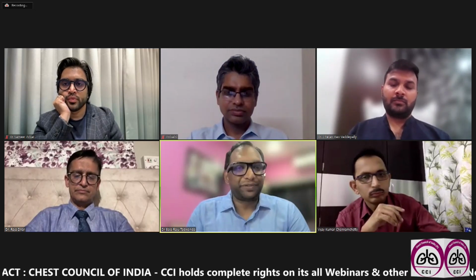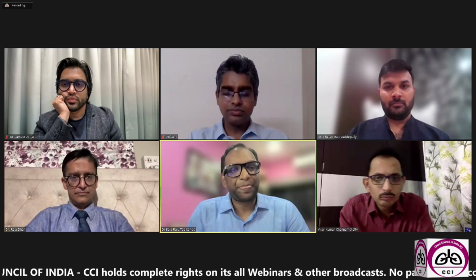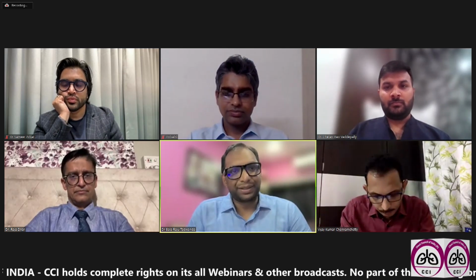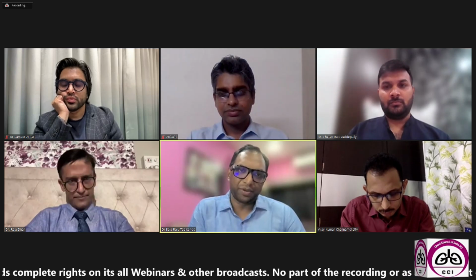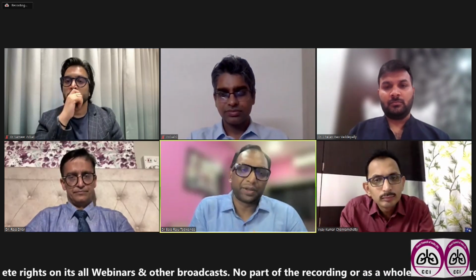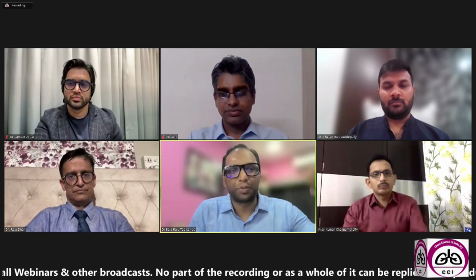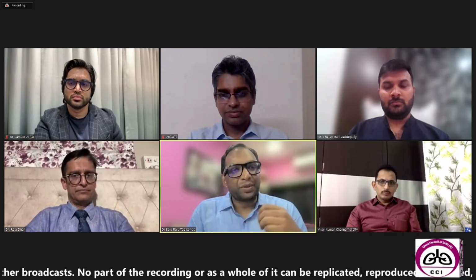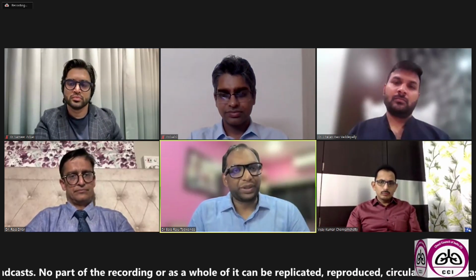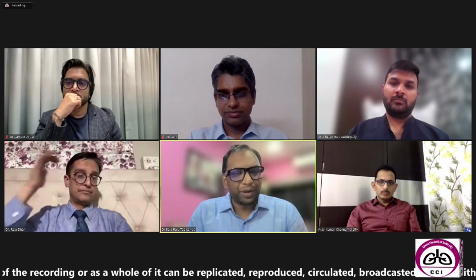Forget about that. So coming to the question, I always feel safety is the utmost priority, especially for cryo. So to answer your question, sir, yes, I feel that rigid should be the way to go if you want to do a cryo lung biopsy or debulking. There's no point in discussing whether you should use rigid or not. But even if you want to do all the cases under rigid, you can't do all the cases under rigid.